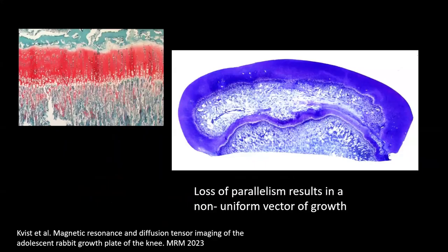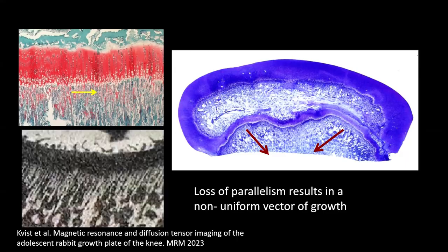So we have this structure, and the growth is perpendicular to the growth plate. So it's very important that nothing happens to it, such as Salter-Harris fractures, infection, or something else, because that can affect it. We can even see the symmetrical pattern on a CT that shows the calcification, not the water itself, or the chondrocytes, which could actually be a pattern with a symmetry that we can measure.